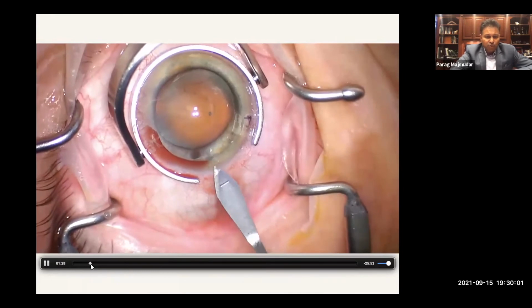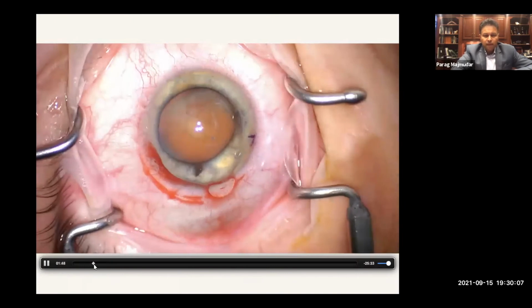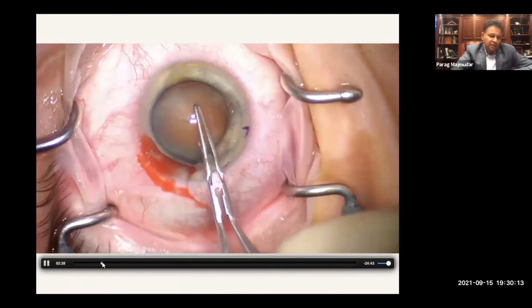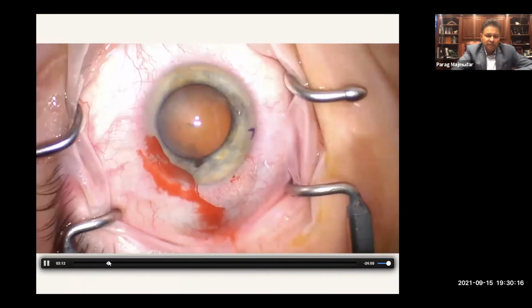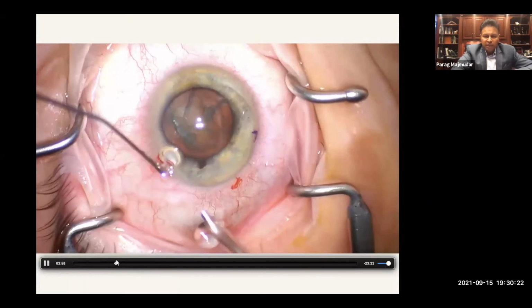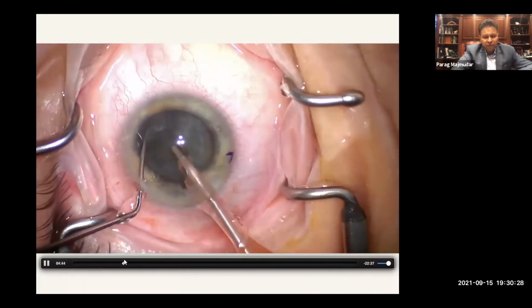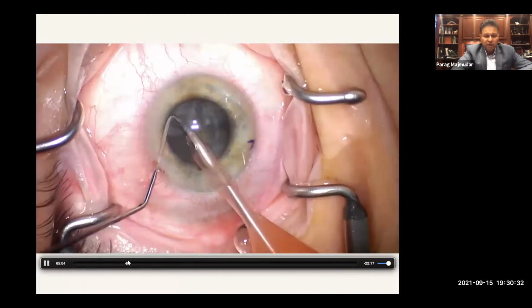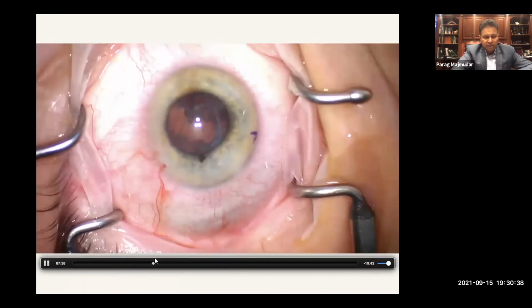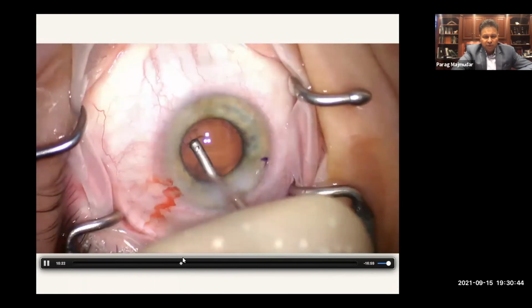I'm not going to bore you with my cataract skills, but I can fast forward a little bit to the highlights here. What we're trying to do, of course, is to get the lens out safely and securely. And here, sometimes I don't mind. Typically, my cataract is a chop technique, and I'll use basically iris plane phacoemulsification. I won't prolapse the nucleus into the anterior chamber, but you could in this case. You definitely could, because you don't really care about the endothelium, as you're going to be replacing it very shortly. And so here we're getting the cataract out, and then I'm removing the cortex.